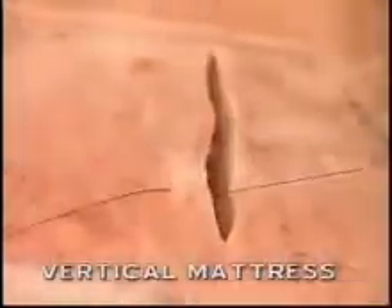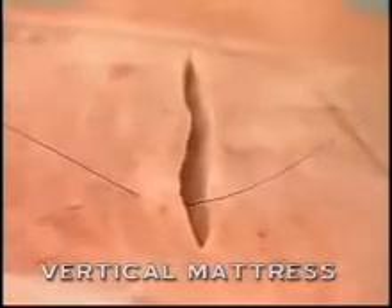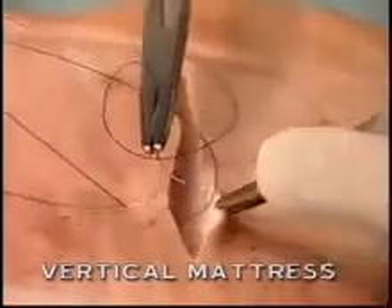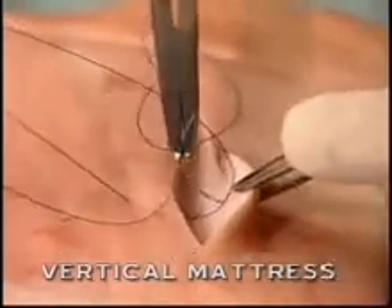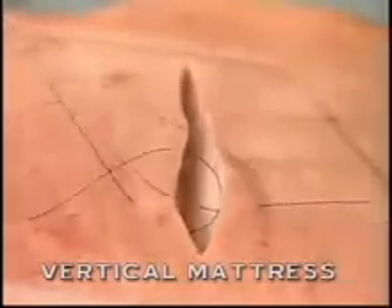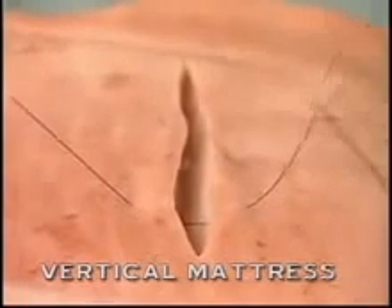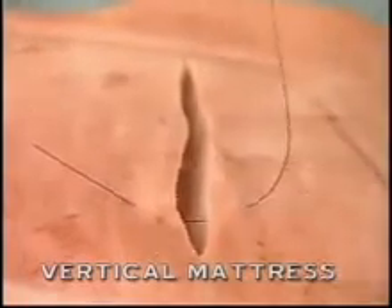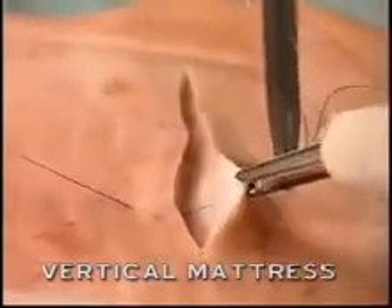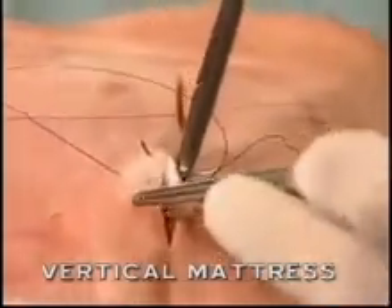The vertical mattress suture: the far-far component is placed initially, entering the skin and emerging beneath. The needle is removed with the hand in pronation, then brought directly across in a mirror image fashion to the opposite side.